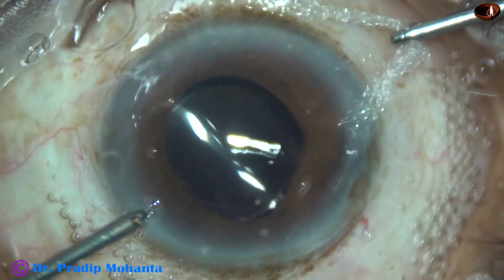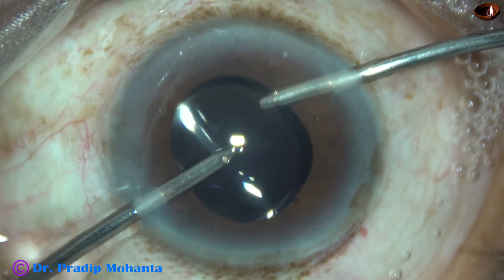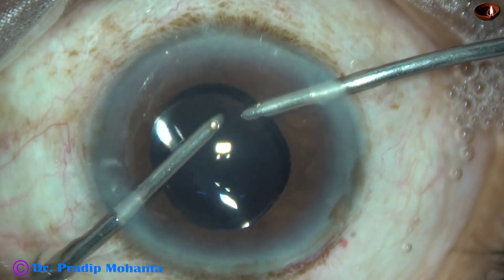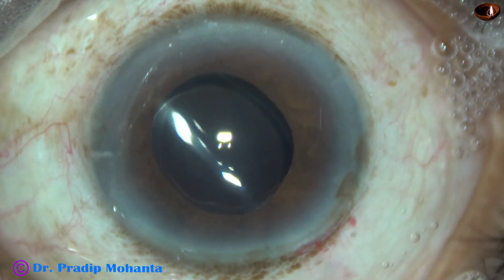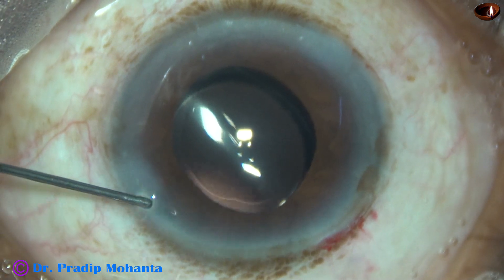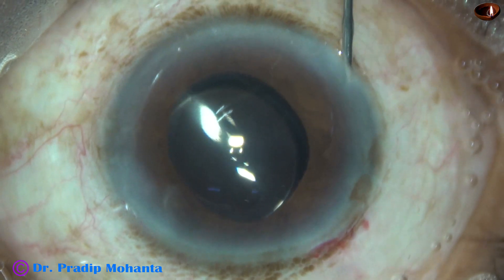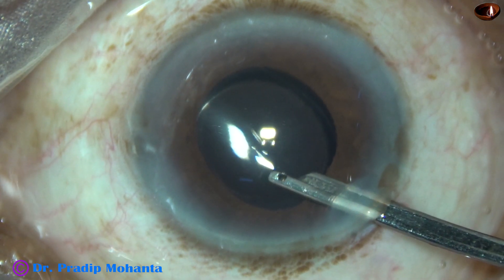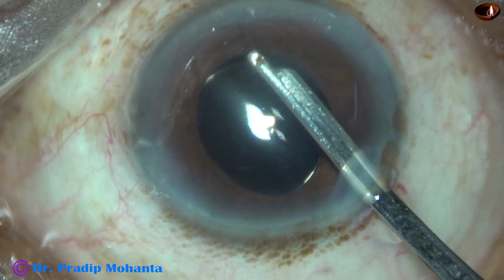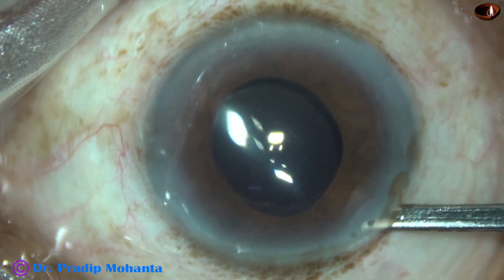I used Simcoe for some time and then bimanual irrigation-aspiration for removal of the viscoelastic substance. After nice cleaning of the viscoelastic, the side ports are closed by hydrating corneal stroma on either side of these stab incisions. This is the final lavage of the anterior chamber. The anterior chamber is nicely formed by the Simcoe.